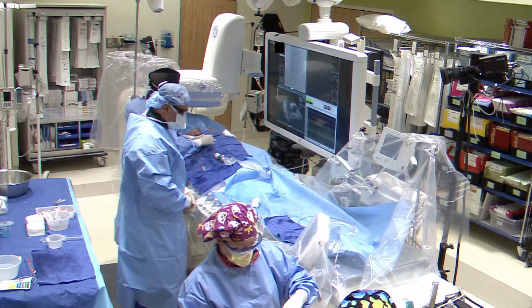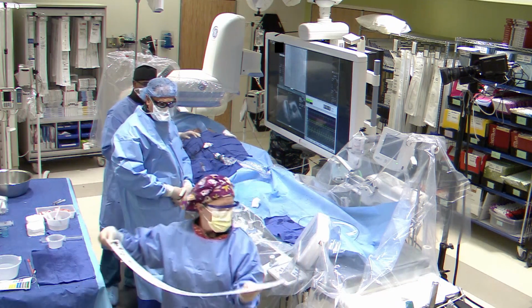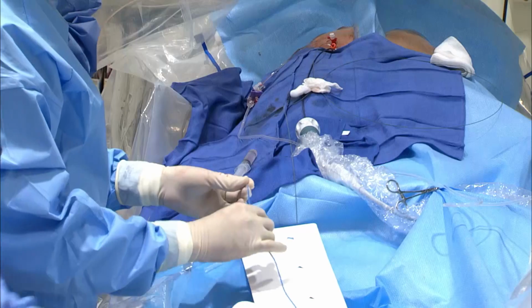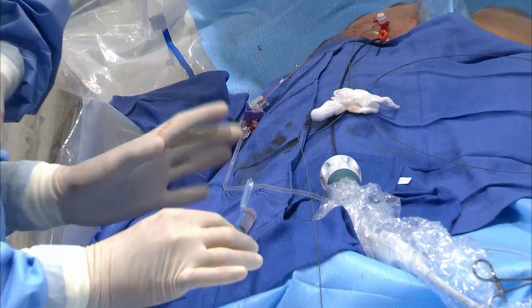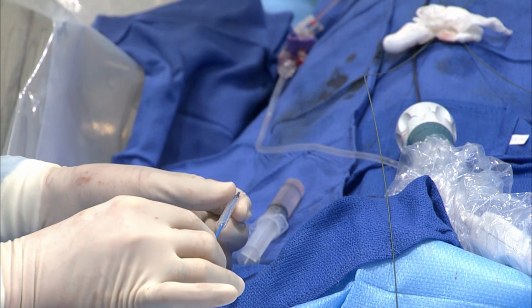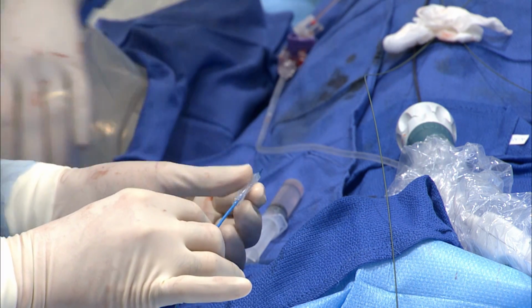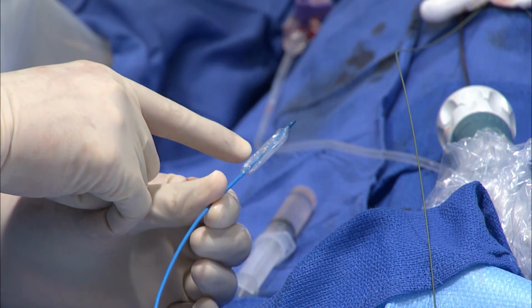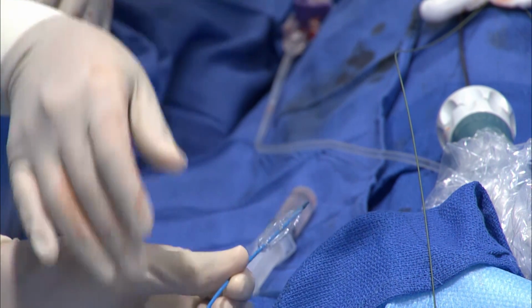So we're going to show you this balloon. It's a compliant balloon, so it stretches. Some of you who might be familiar with the AAA procedure, we use the same type of compliant balloon to treat post-endograft, to oppose endografting. It's a similar type balloon. It has a very, very thin surface and a central marker that helps us with the measurements. Once we inflate the balloon, we'll explain how we measure the size of this device.